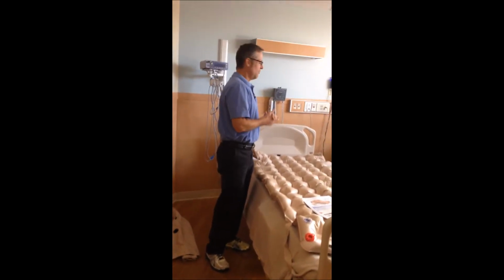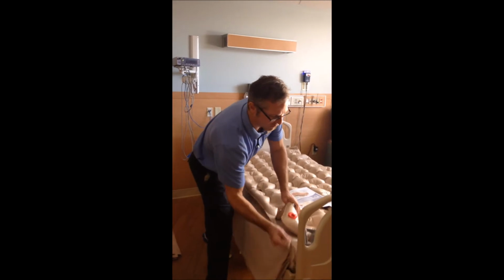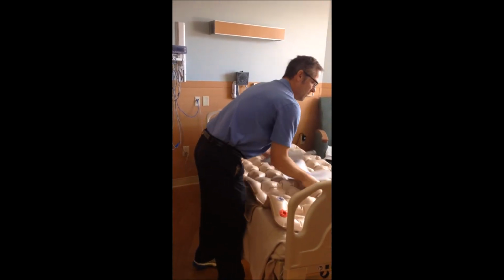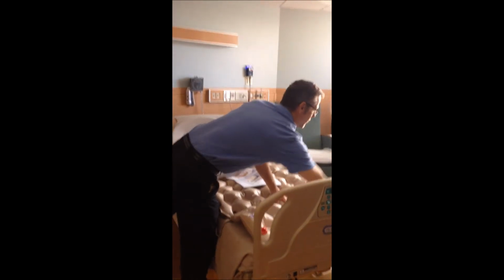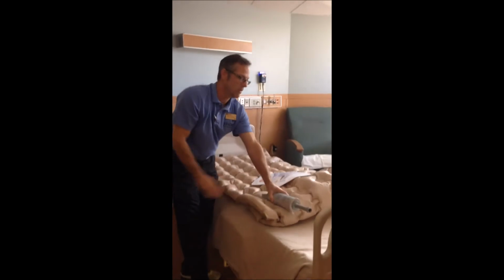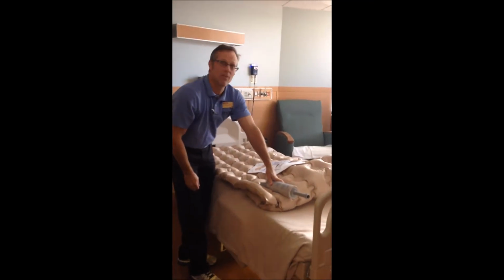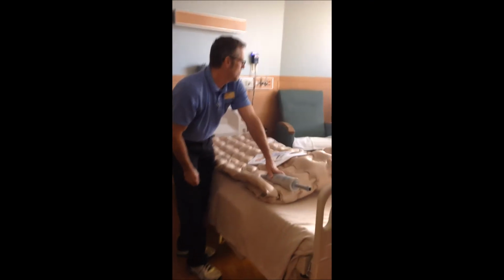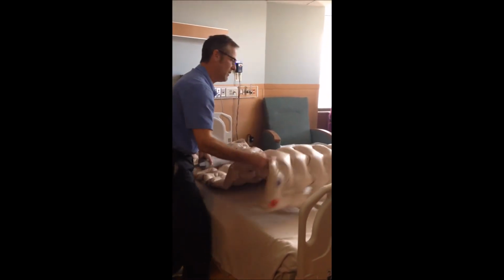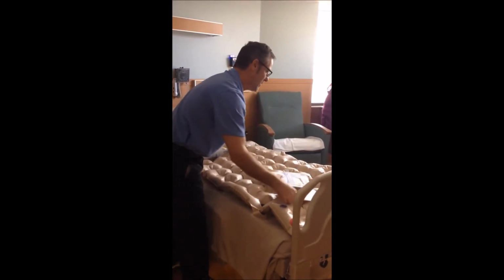A couple of things you can use this for: for low-risk patients, for their heels, as opposed to using a pillow. You could take the bottom of this and fold it underneath itself, just like this, and then you'd have a heel off the bed like that. Once again, this is for your low-risk patients, where you'd use a pillow or something like that. You can use that.